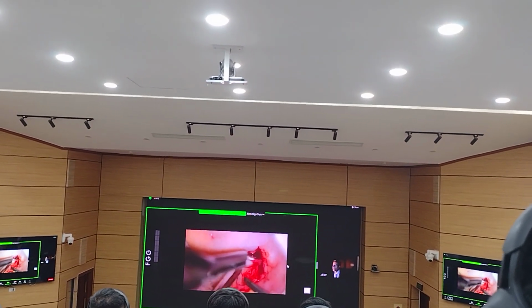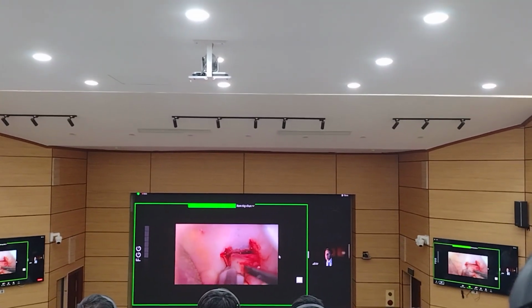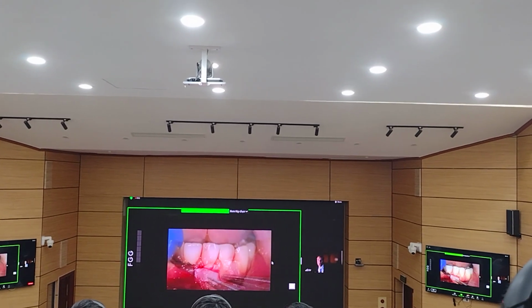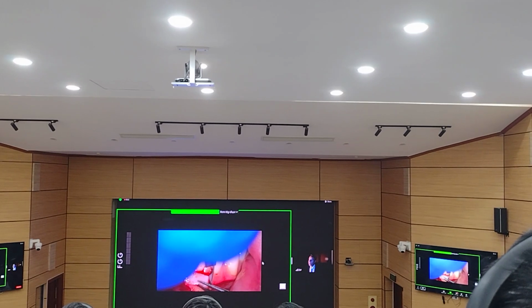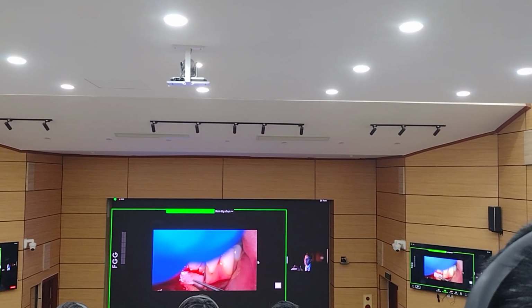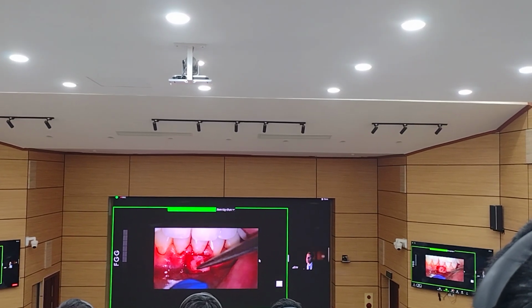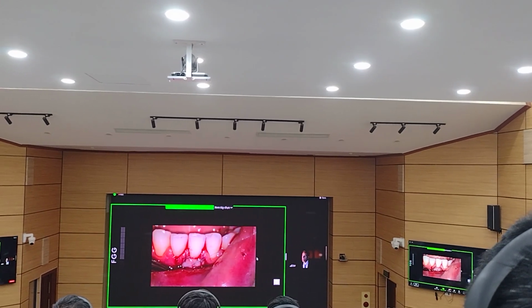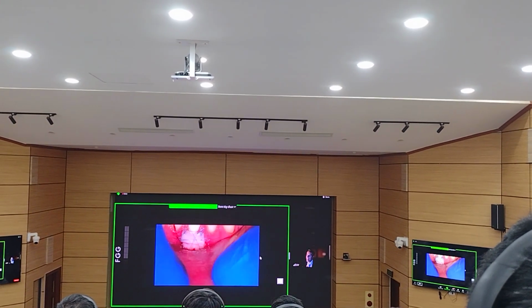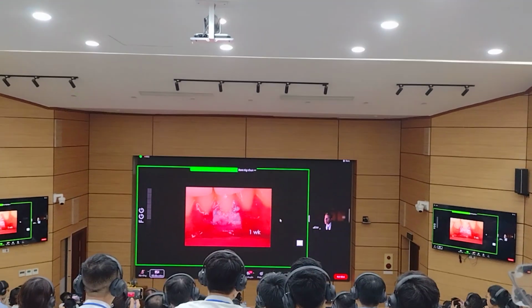I like to go to the roof of the palate after I have measured the area that I need to work with. And sometimes I get a mix of connective tissue alone and then some epithelialized surface. I like to bring the material that I have harvested and I'm going to design the recipient site based on the size of the graft that I have borrowed. And then I'm going to secure it with sutures to approximate and have a good coaptation of the wound edges, and that is going to allow us to have the best perfusion and the best vascularization that we can obtain.